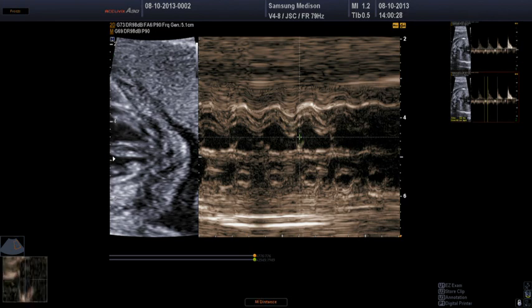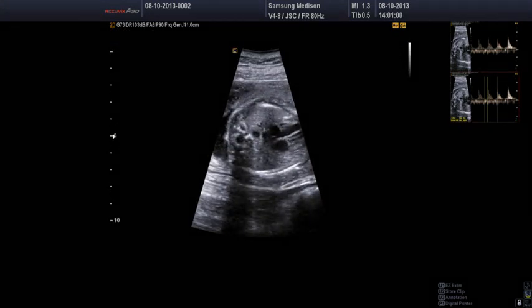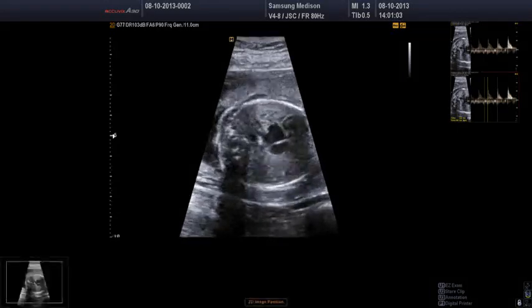And you can make measurements here of the widest diameter, which, if we have the mitral valve here, you can see when the mitral valve closes, and measure from the posterior wall to the septum, and do the same for systole. Then either use a package on the machine, or you can calculate the shortening fraction, which is the end diastolic minus the end systolic divided by the end diastolic, and you have an objective assessment of ventricular contractility here.